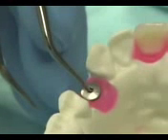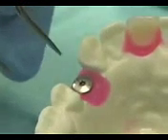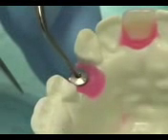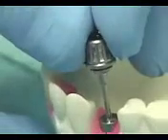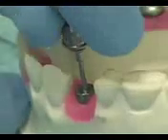Now many times when patients come back for their 3-month visit, there will be little bits of food debris that plug up this little recess. So what one wants to do is take an explorer and go in here to make sure any food debris is cleaned out, and then rinse it with an air water syringe. Once that's been completed, the screwdriver fits into the end of our healing abutment, and we carefully just unscrew the healing abutment. And that will lift right away.